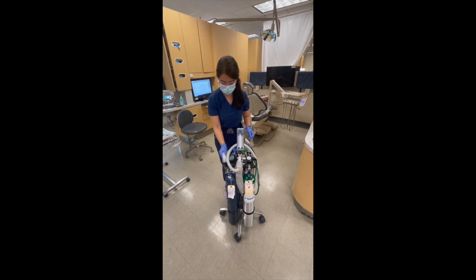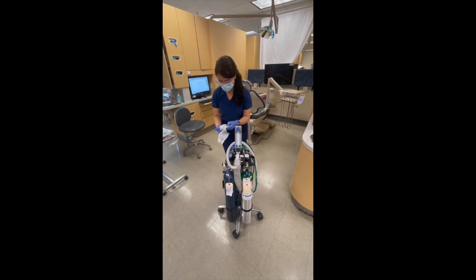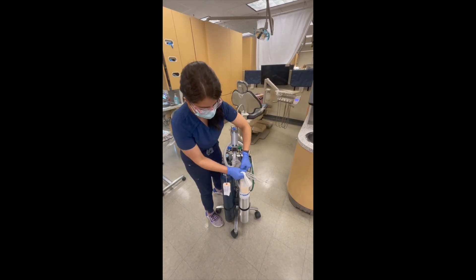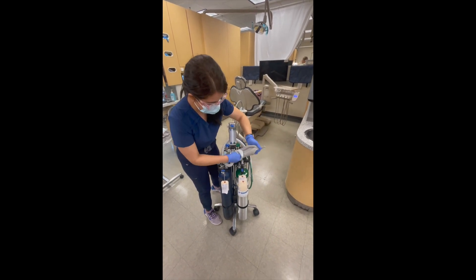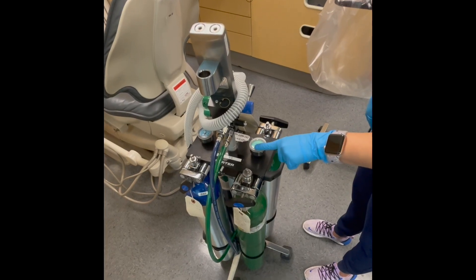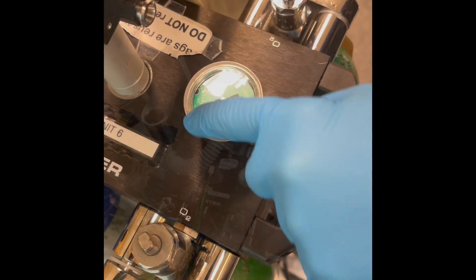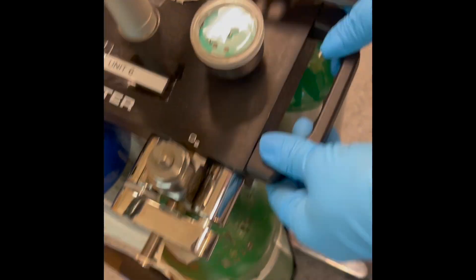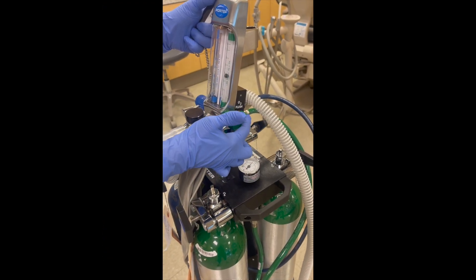Once the unit is clean, place the appropriate barriers over it. Make sure that the tanks are closed and that the gauges read zero. Start turning the knobs slowly and determine which tanks you will use that contain enough gas for the duration of your treatment. Remember to close all the tanks again and flush until you're ready to use them for your patient.